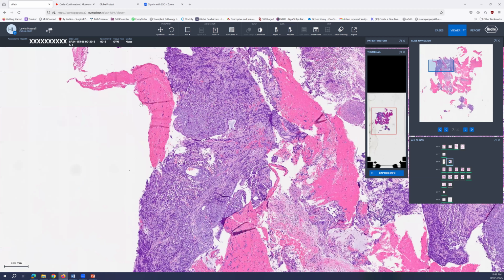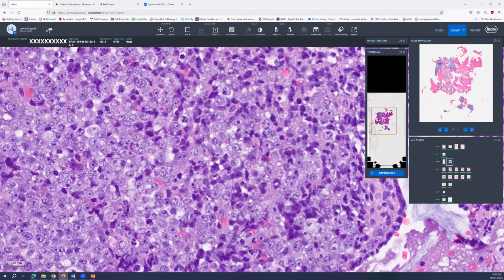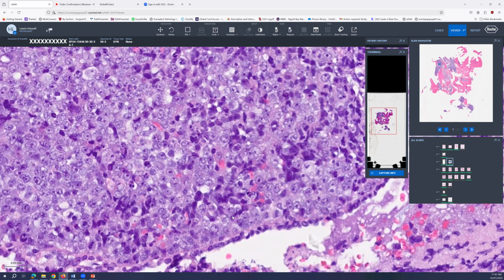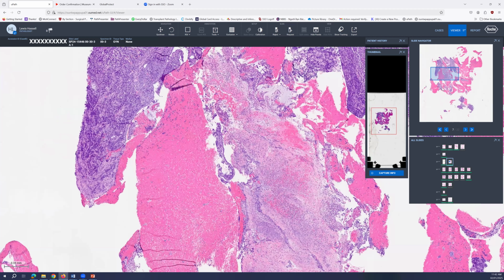But then, as you can see here, we have a very high-grade malignant process with a few sheets of cells, prominent nucleoli, mitotic figures, karyorrhexis, and all of this underlying a relatively banal or benign surface cuboidal type of epithelium. There wasn't a lot of this, but it was clearly present in several of the fragments and associated with some necrosis, as you can see here as well.